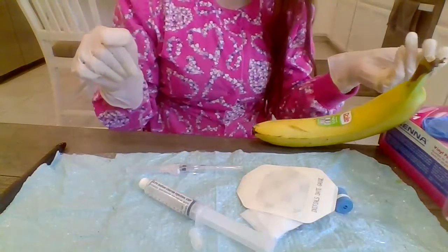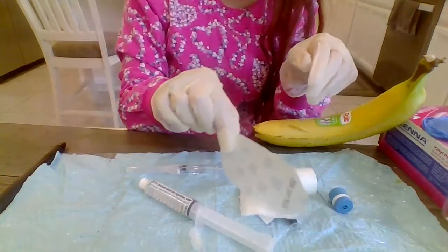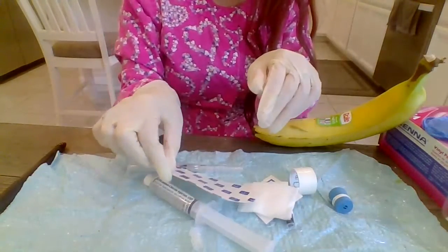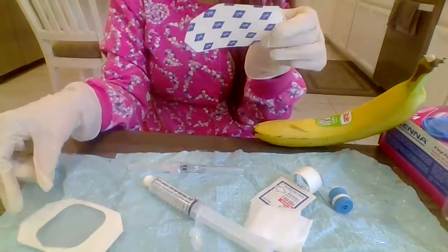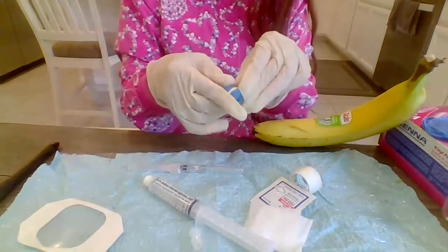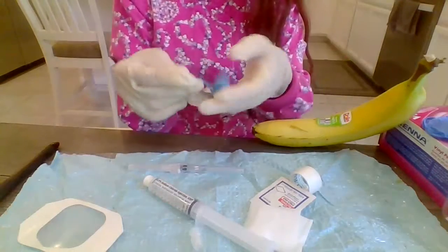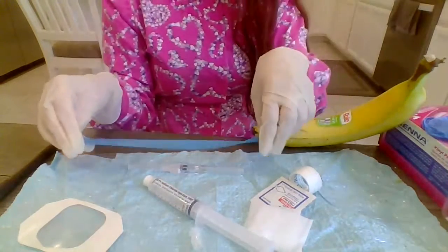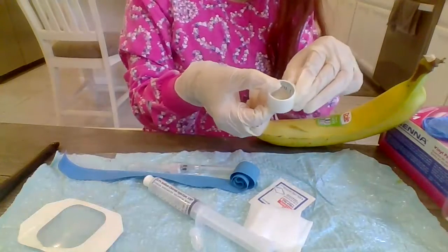Now I'm going to prepare the equipment. I'm going to open the Tegaderm and just drop it there. And I'm going to open up the tourniquet. Just leave it here. And prepare the tape.